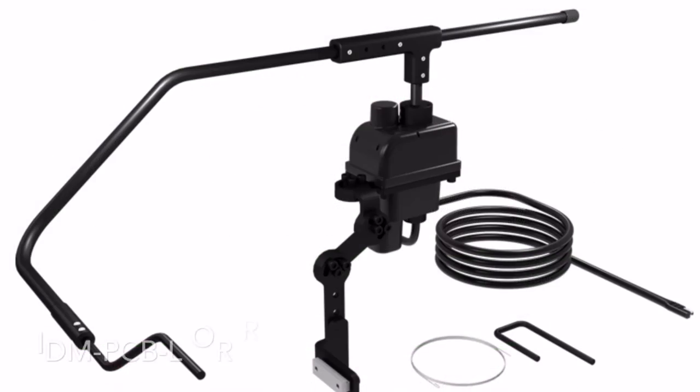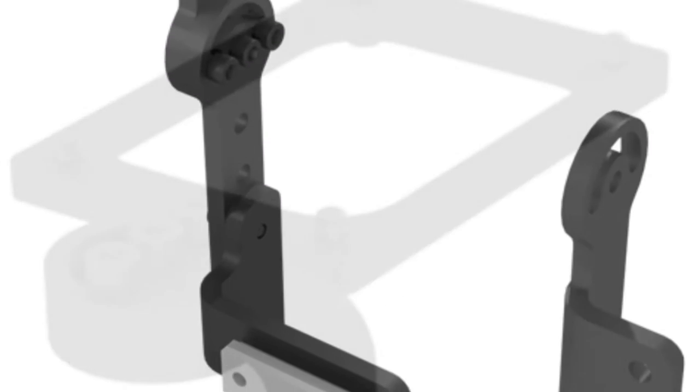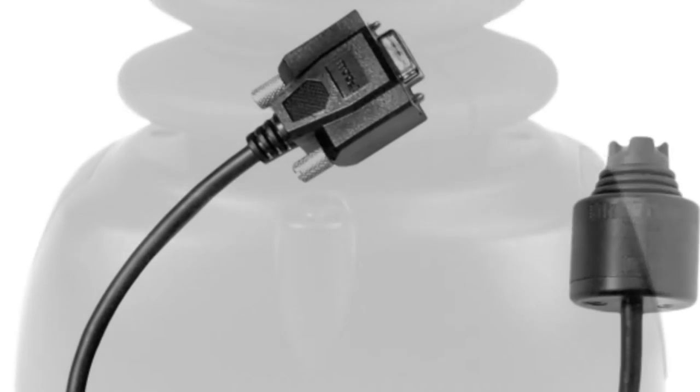The Power Chin Boom is available for Quantum and Permobil chairs and most power chairs that are out there. Brackets allow for height and angle adjustments of the Power Chin Boom in order to accommodate the client's needs. We have mounts for our Micro, our Multi, our All-Around Joystick, and also our PMPJ.